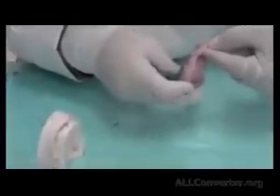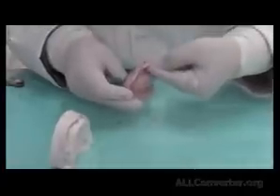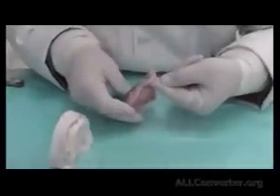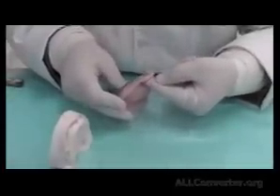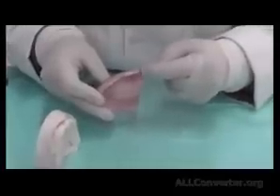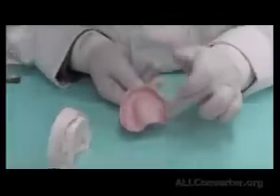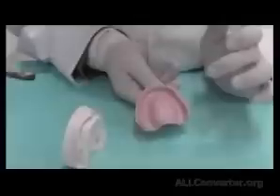If I have found that my finger goes in here more than here, that means it's under-recorded. So what I could do in the patient's mouth, I could add green stick border molding material to fill in this space. So this is the check we do. The surface is continuous. My minute bubbles are acceptable.